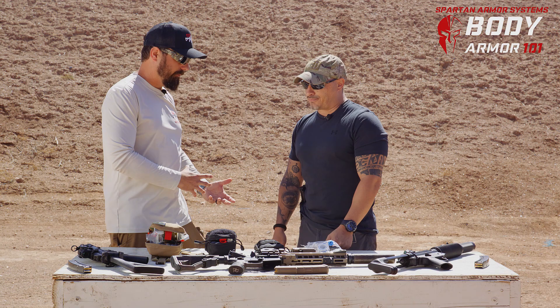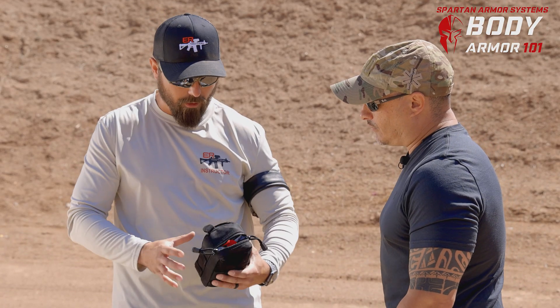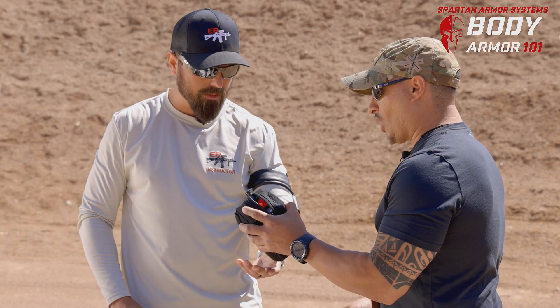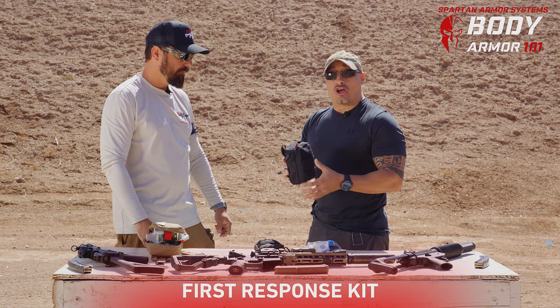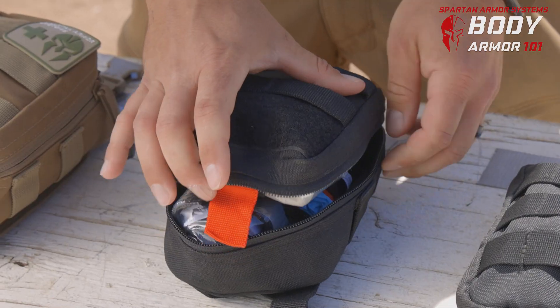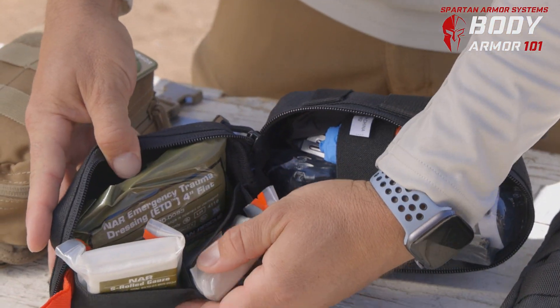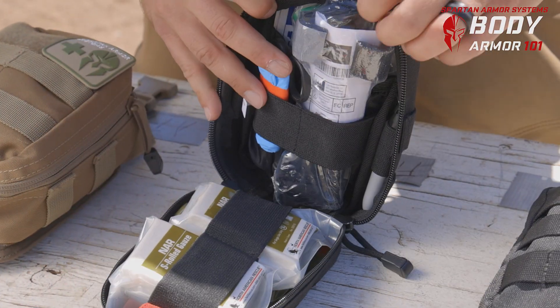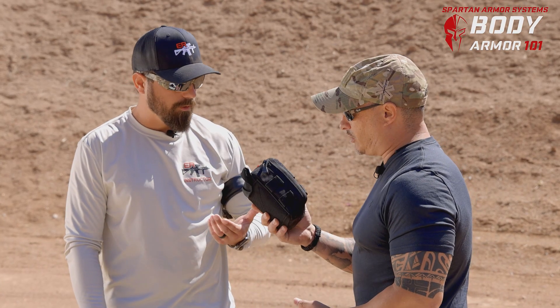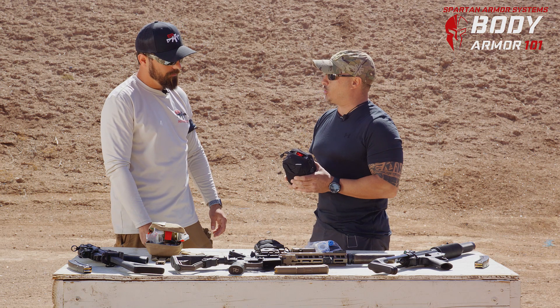On the other side of that spectrum, the First Response Kit is a much larger kit that hangs off the belt — it's Velcro and MOLLE, so this isn't something you tuck away. It's designed to be on your pack, your MOLLE, or your belt. It has two different types of tourniquets, and everything to fit the MARCH algorithm: massive bleeding, airway, respirations, circulation, and hypothermia. It can probably take care of more than one person, or multiple injuries.